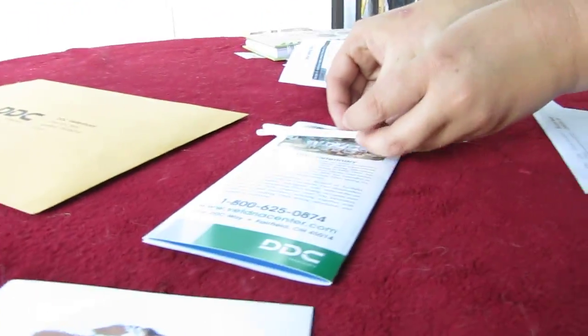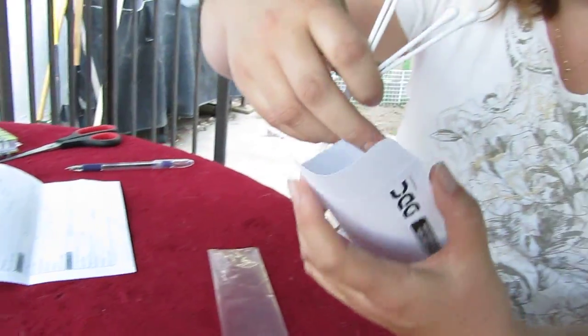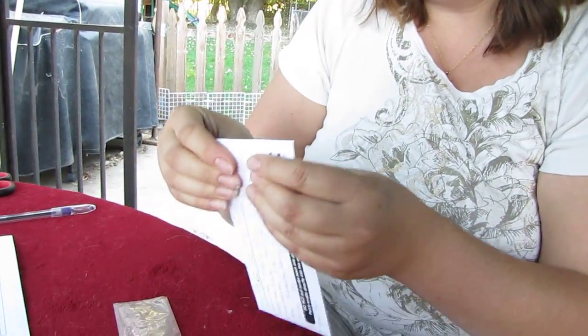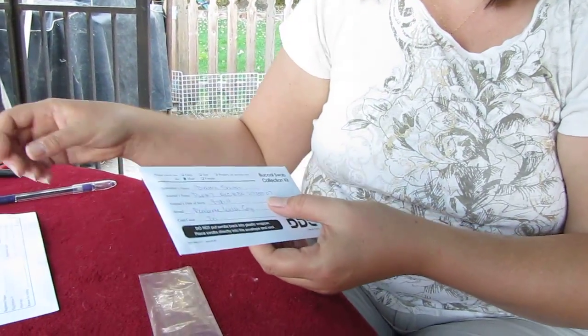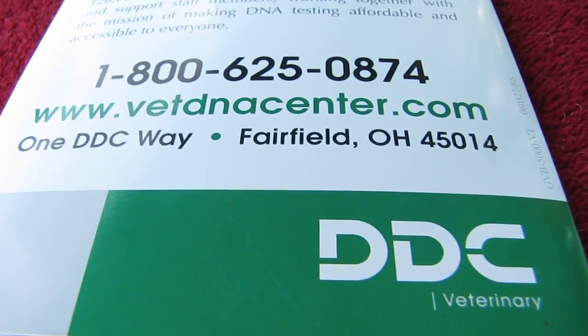Once you have completed the collection, take the swabs and drop them head-first into their envelope, then seal that envelope so we can send it off to the testing company. We use DDC Veterinary — their website is vetdnacenter.com.